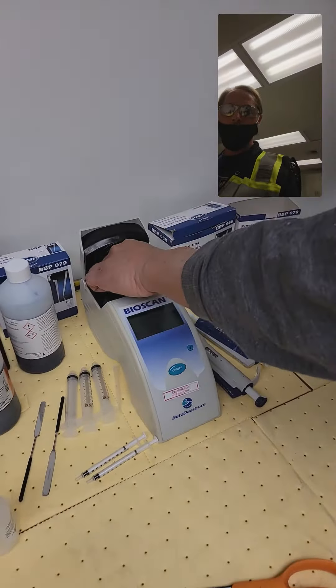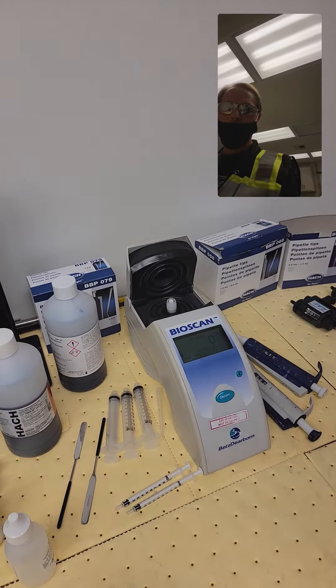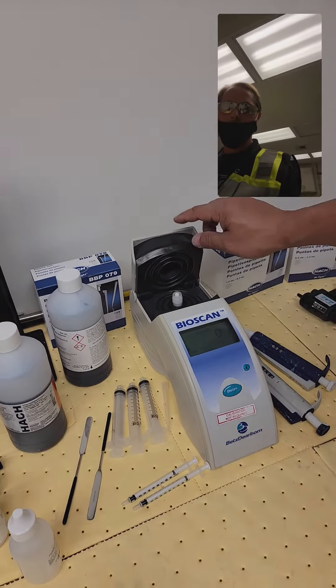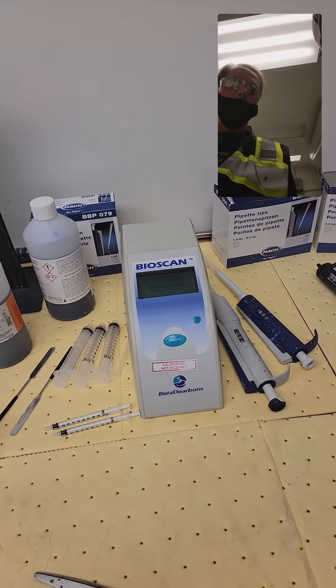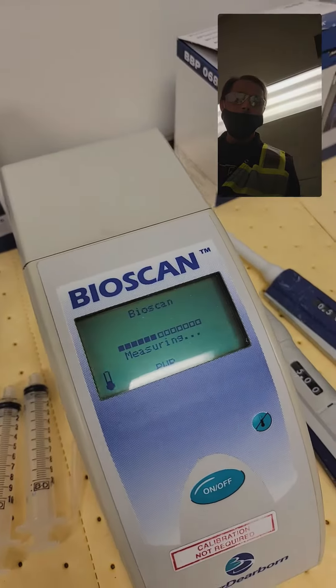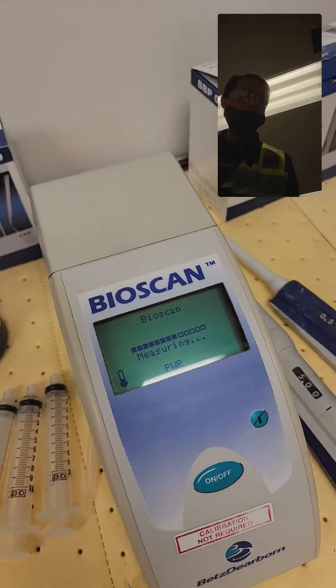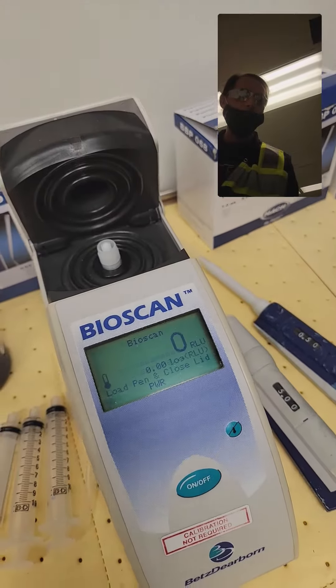In the bioscan machine, just drop it down in slowly, close the lid, and it'll run automatically. If you ever come on to this and it gives you some kind of warning, that means you just need to reboot it — turn it off, take the pen out, and it will recalibrate. Sometimes you have to do that.